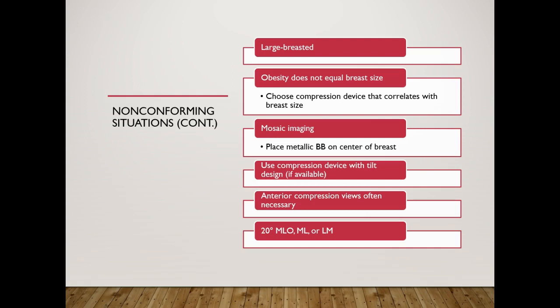Often these are the types of patients where the oblique angle is not going to be very steep. So here you may be doing an MLO that's only about 20 degrees.